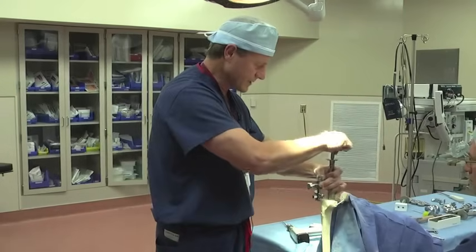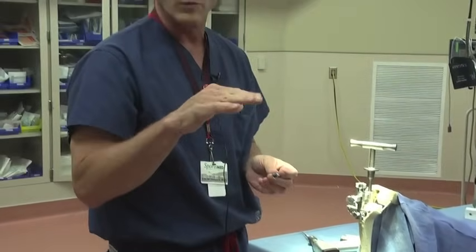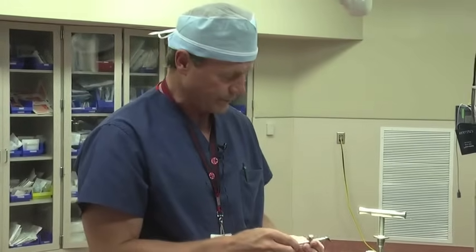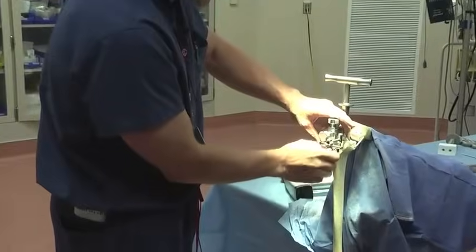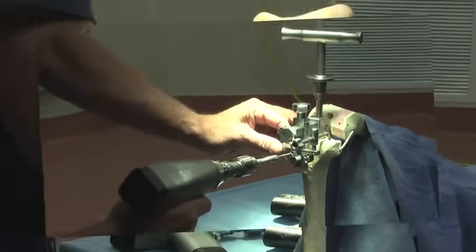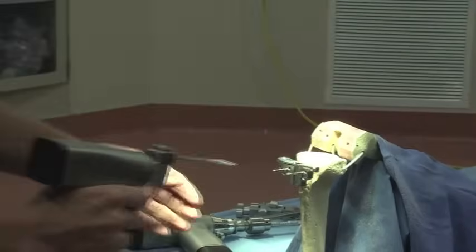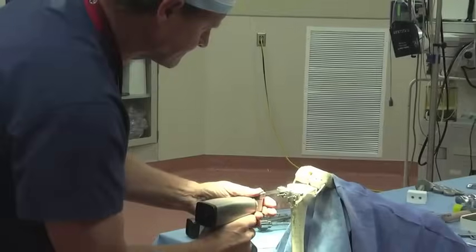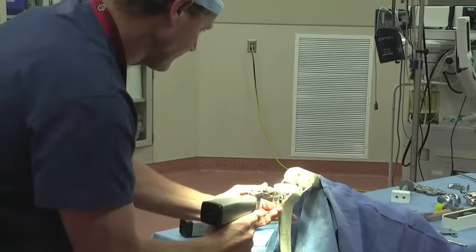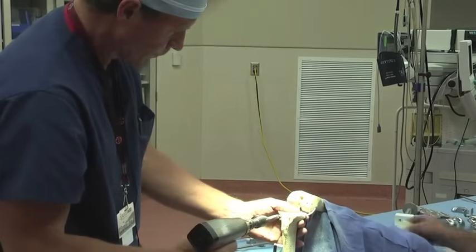Next, the rod will be placed down the tibia. We want to determine how far down the tibia we're going to make the cut. All we're trying to do with these implants is make enough cut on the bone to get the implant in to the level we want. When we get to that height, we lock that in, then go ahead and place our pins again. Usually we're doing a pretty flat cut here with just a little bit of slope to the back. The block then comes back off and we remove our pins.